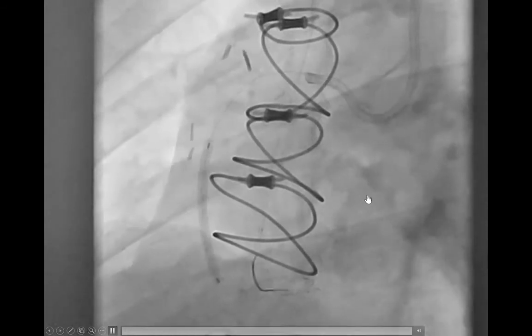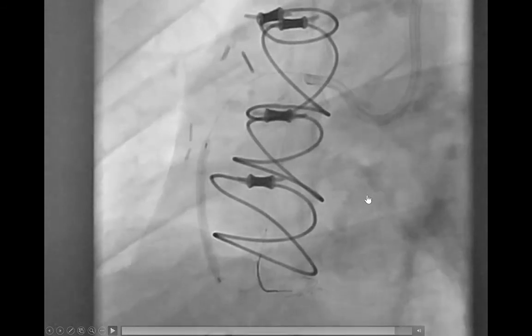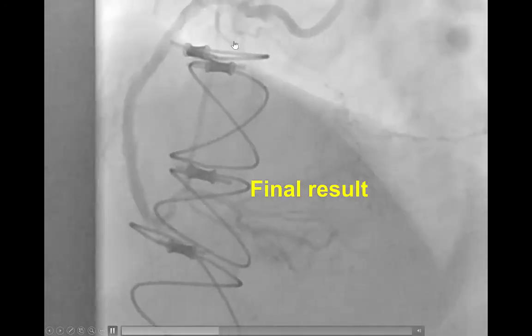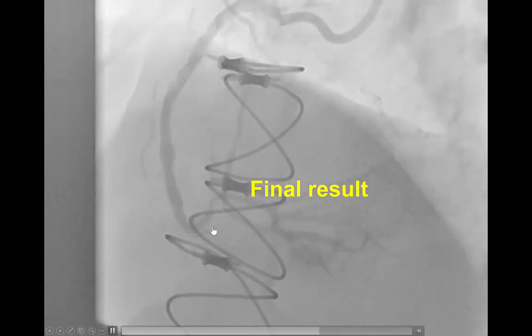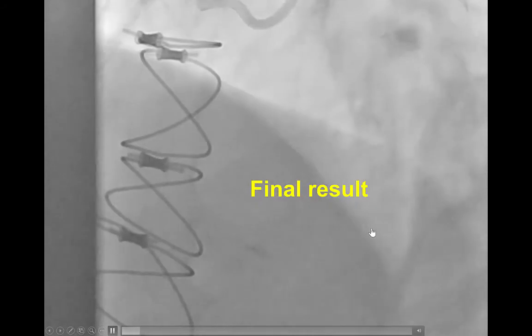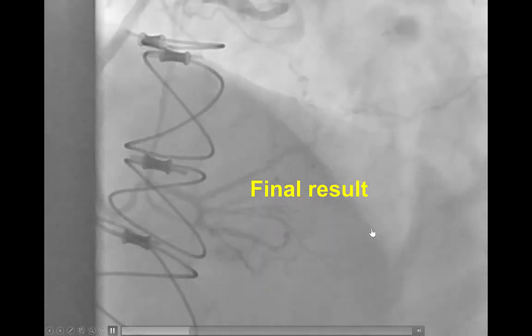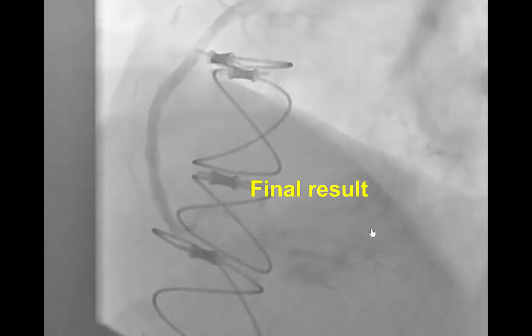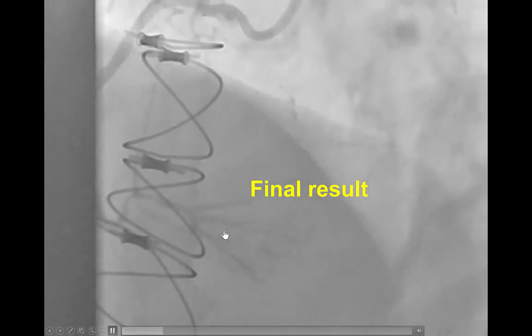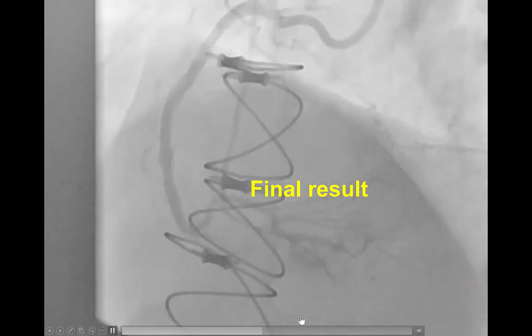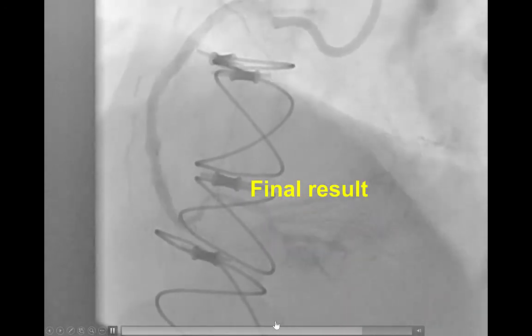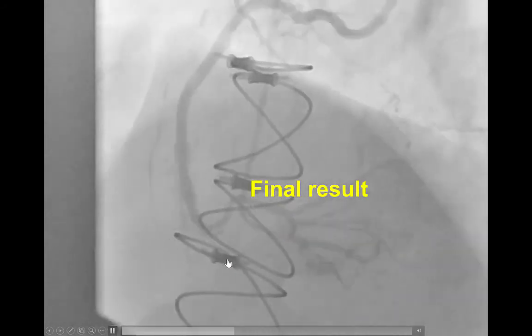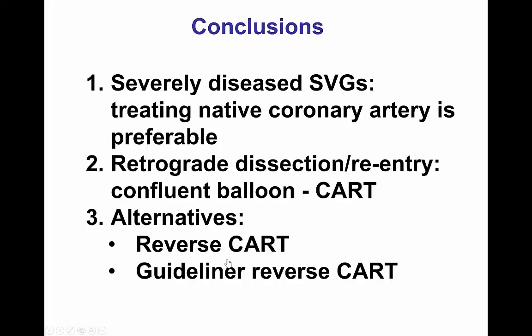After that, stents were placed in the mid- and proximal right coronary artery, and that provided a nice final result with TIMI flow into the distal right coronary artery. We did not embolize or coil the vein graft. There's a debate as to whether the vein graft should be coiled afterwards, but we did think that this graft had a severe distal anastomotic lesion and was likely to occlude by itself without requiring coiling.